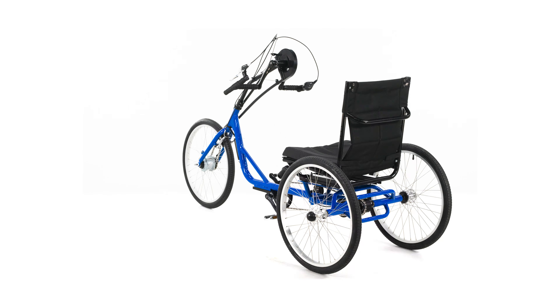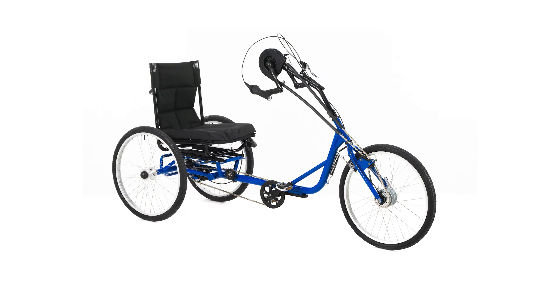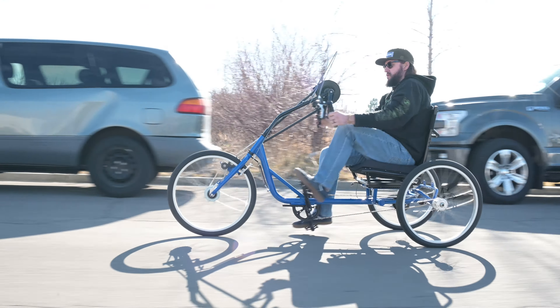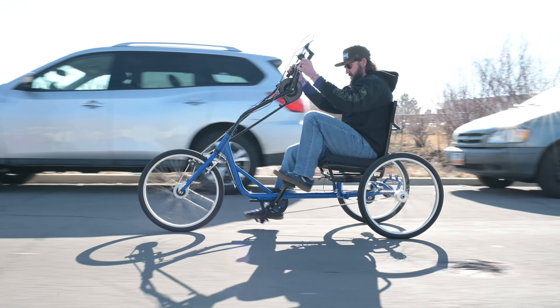We also offer a version of the HT3 that includes pedals — it's the UT Custom Sun HT3 Hand and Foot Cycle. Why offer a hand and foot cycle? We have a handful of customers who need to be able to exercise their legs but don't quite have the leg strength to ride a conventional bike or trike. The hand and foot cycle allows them to use their upper body strength to power the trike while also getting much needed exercise for their legs.